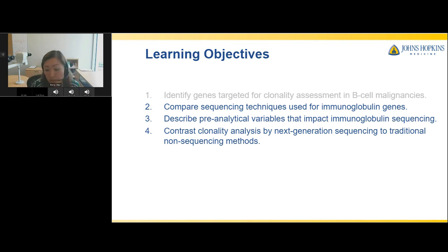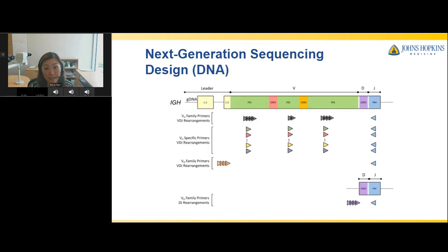So knowing the structure, which is predictable, of the different V, D, and J gene rearrangements, we can actually think about how to design a sensible assay. Since genomic DNA and cDNA configurations of the Ig receptors are somewhat different, different strategies may be applied, whether you're starting from DNA or RNA. So let's start from DNA first.